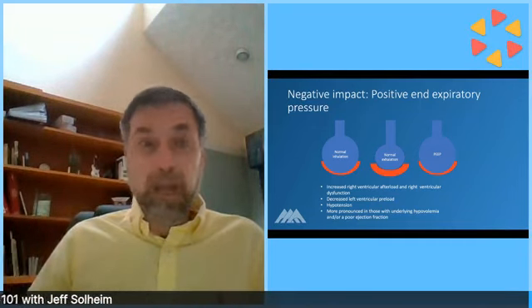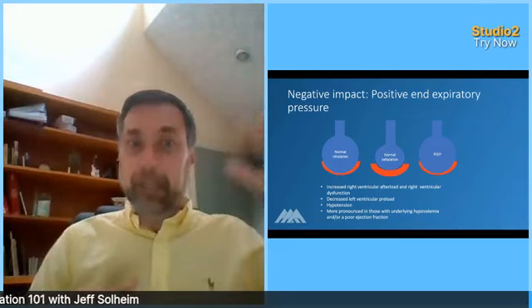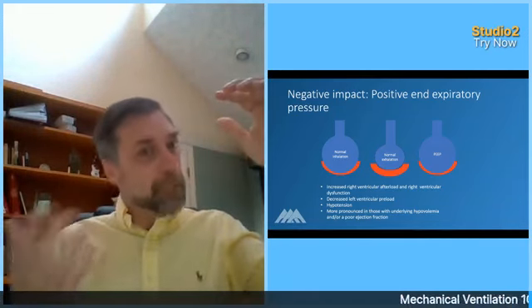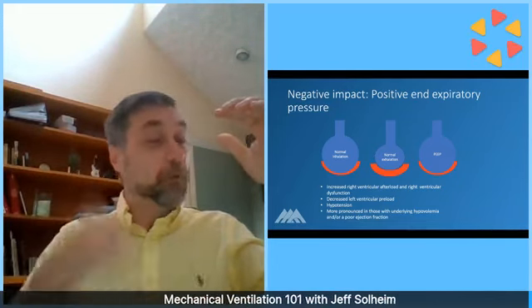The problem is, if you give your patient a bunch of paralytics and other drugs for intubation, their blood pressure may be lower. So I might have to wait for some of the effects of the drugs to wear off. I might need to give my patient a fluid bolus or throw a vasopressor at them, get their pressure up. And then when their pressure is up and I feel confident that their pressure is stable, then I can increase the PEEP, maybe from 5 to 10. Now, I expect that's going to drop the pressure a bit, but if I've stabilized the pressure and they can tolerate a bit of a drop, then we're good.